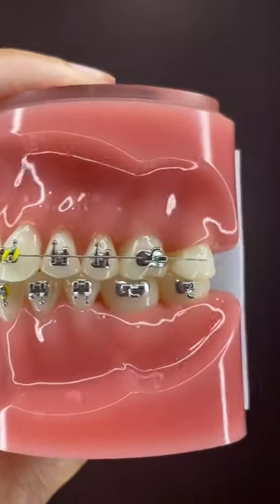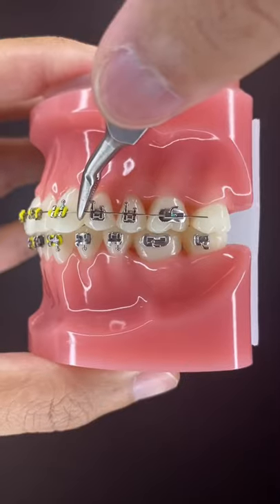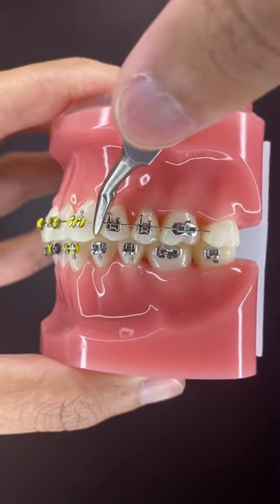One, make sure that the wire didn't slide. If it has, one side will be long and the other side will be short. Use your fingers or pliers to slide the wire back into place.